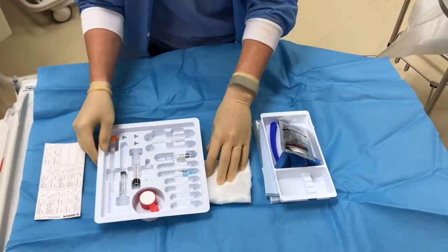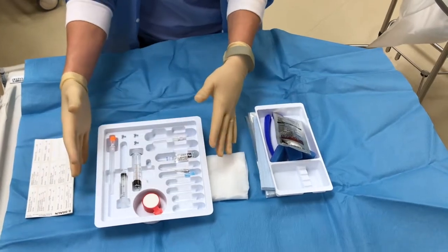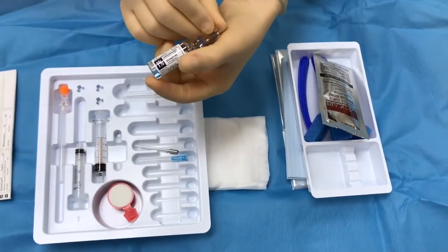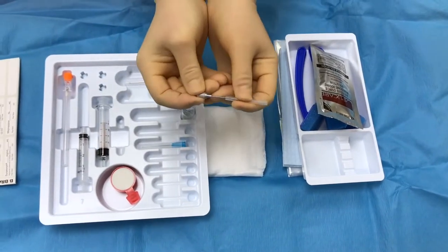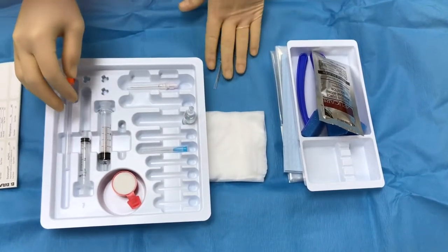Okay, so the spinal kit, if you'll notice, one of the main differences between the spinal kit and obviously the combined spinal epidural kit is that there's no epidural catheter. You still have your 1% lidocaine, which is going to be your topical numbing medication. And then you have your introducer needle. And that will be the second step in the process after you've numbed them.